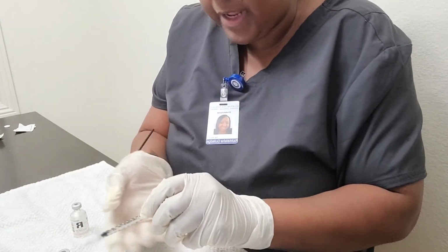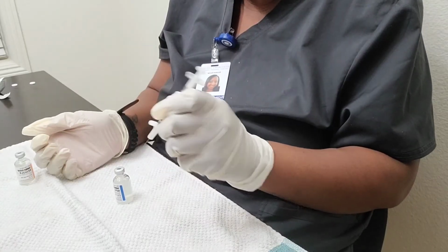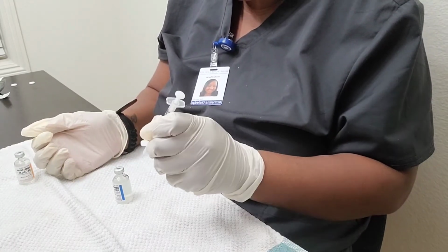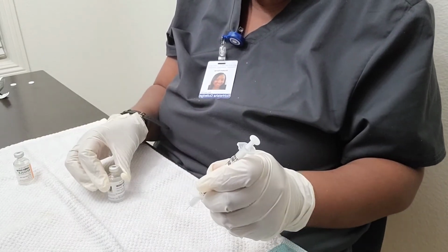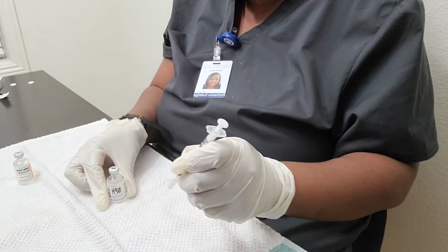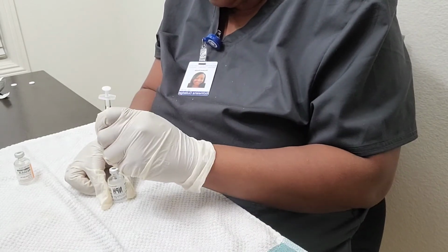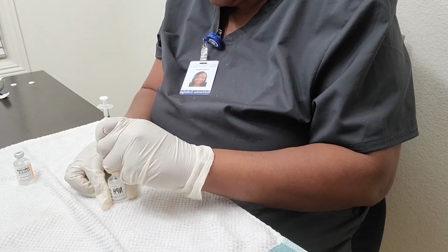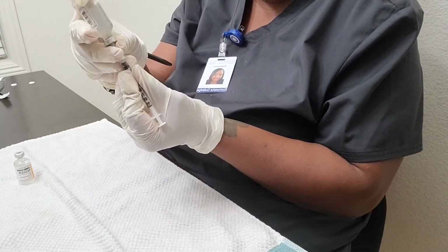Okay, and so now we're going to insert the syringe into the vial of our NPH, the intermediate. I'm holding the syringe with my dominant hand, and we're going to invert it.